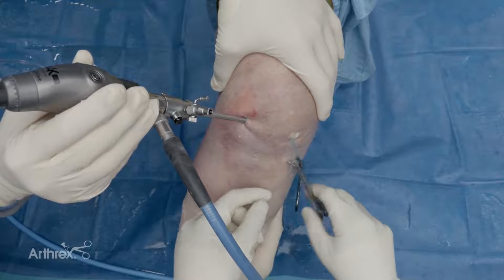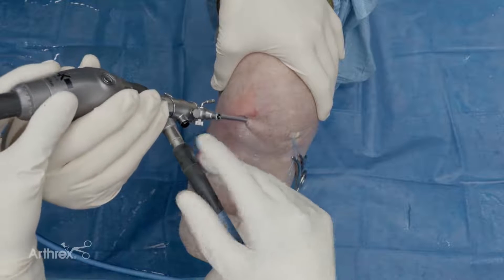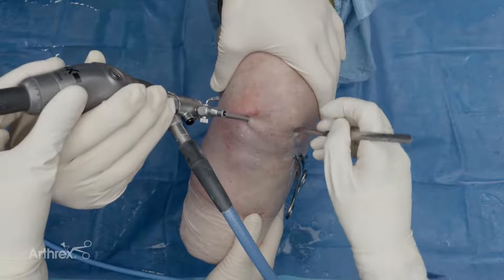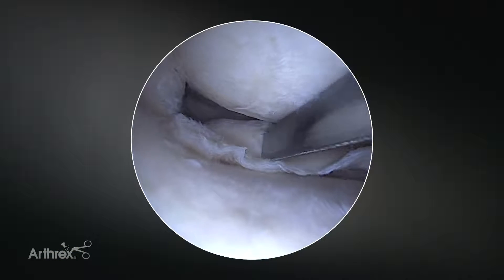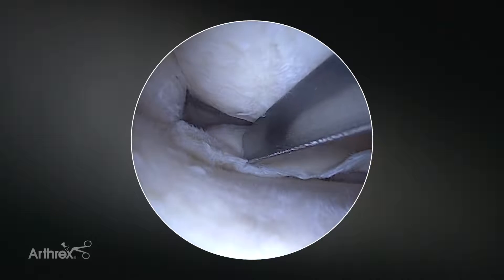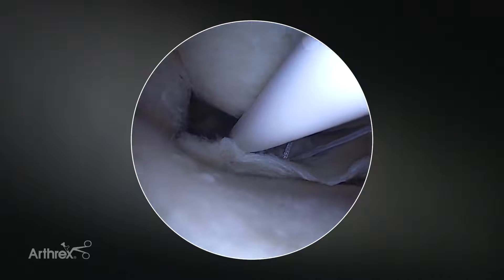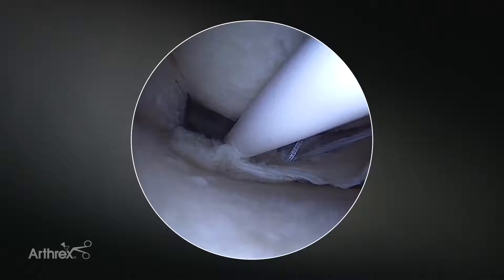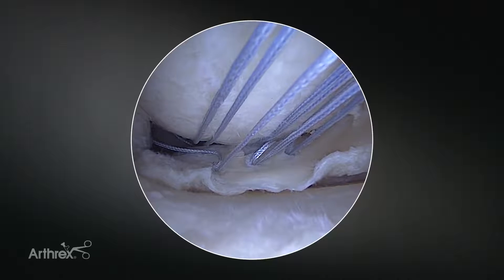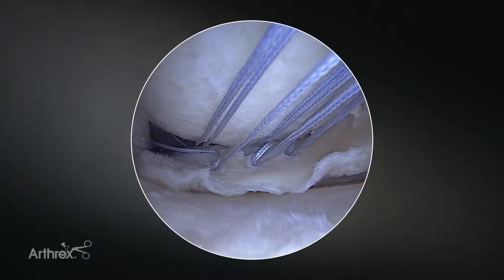This continues to keep each one separate but allows us to continue placing each subsequent vertical mattress stitch with excellent visualization. As you place a vertical mattress stitch on the femoral side, you'll see that the meniscal tissue will start to evert, which we want ultimately to get our tibial sutures in, but it can obliterate your view for subsequent femoral-sided sutures. We'll come in with our final implant — I felt the length of this tear on the femoral side warranted three. You can use the curve to angle away from the midline in the posterior aspect of the knee.